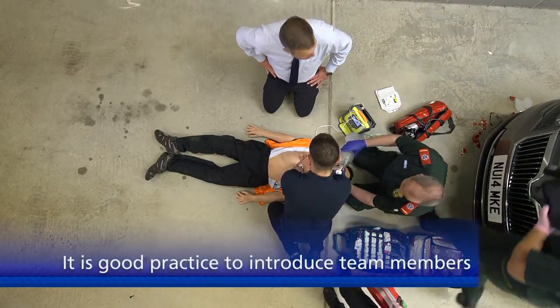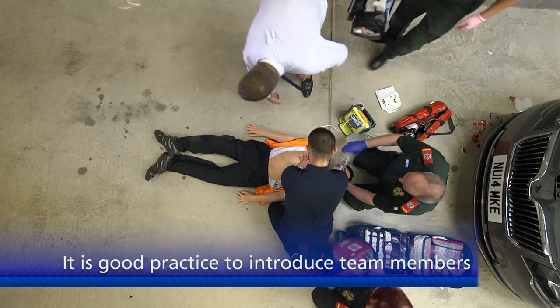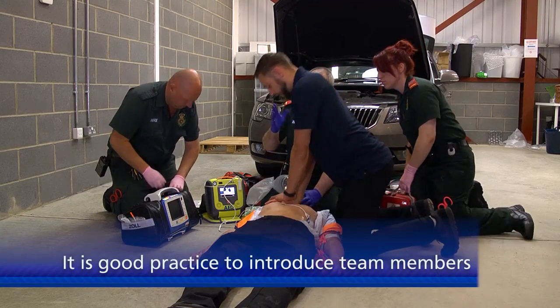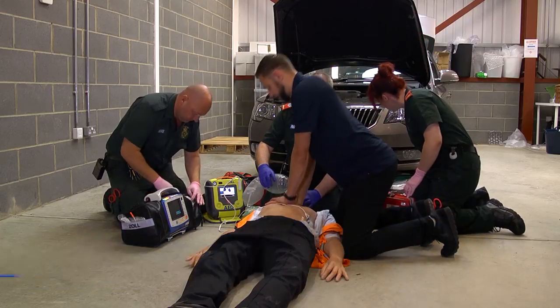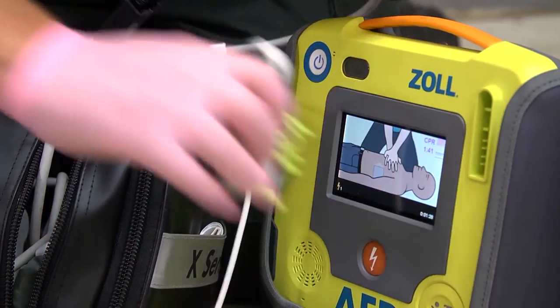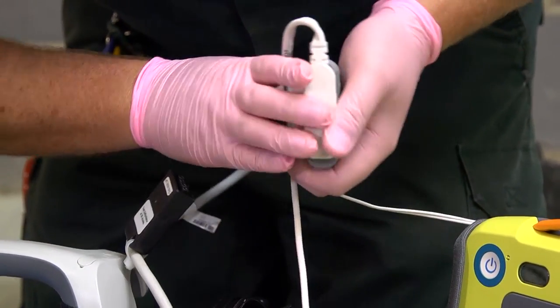I'm Sean, this is Andy. Oh, hi Sean, I'm Steve. Patient's name's Greg. Okay, this is Jamie. This is Nathan. Nathan's a colleague of Greg's. Jamie's our first responder. Okay. Andy, can you switch on our monitor? That's lovely. Okay, just keep going. Plug in the pad's cable.